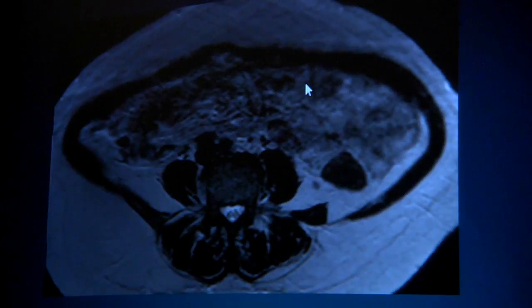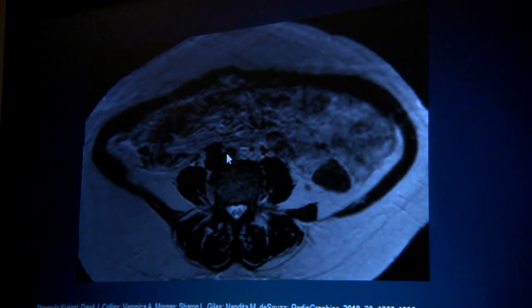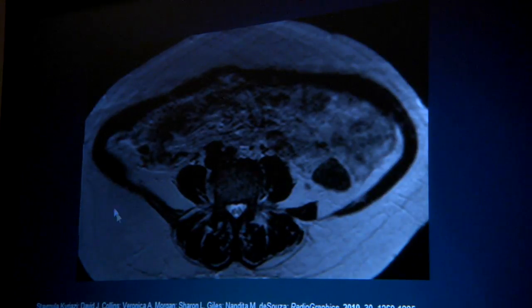And the point is, you look at this image, this is a T2 weighted image, and we frequently are confronted with a situation where we're looking at something like this and there is no CT scan. It can be tough. This is the tough part that Dr. Sugarbaker was relating to. Fortunately, this diffusion-weighted scan, if you can see, this would even be better if it was totally pitch black, but you get the point. There's a diffusion abnormality that we can see in the mesenteric fat.